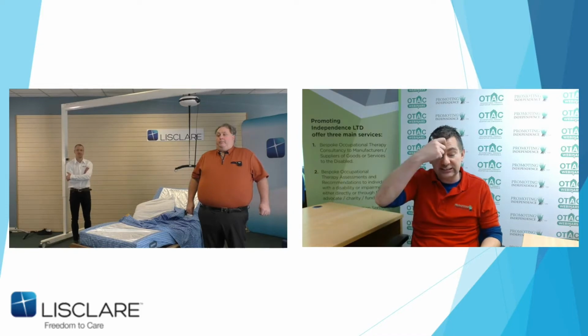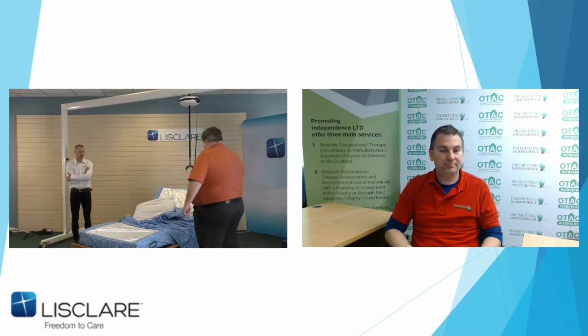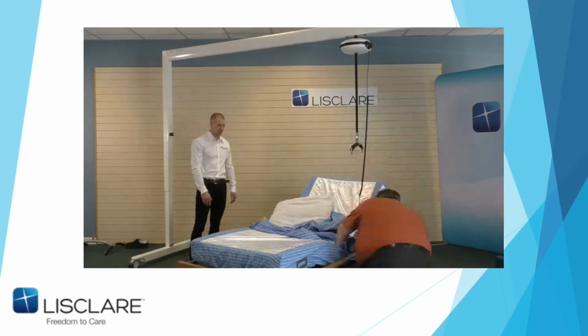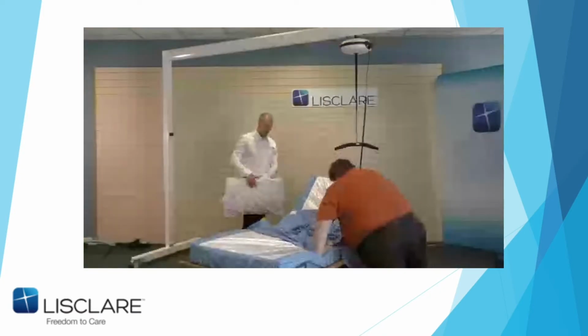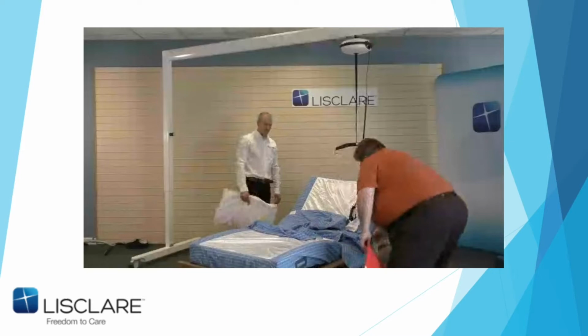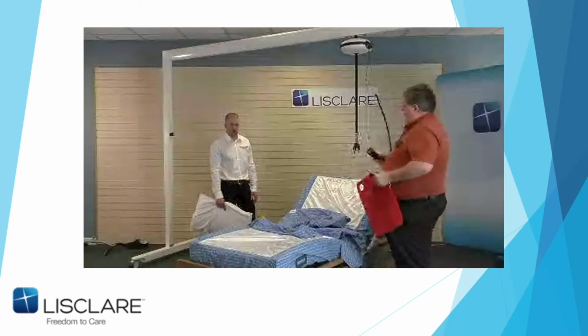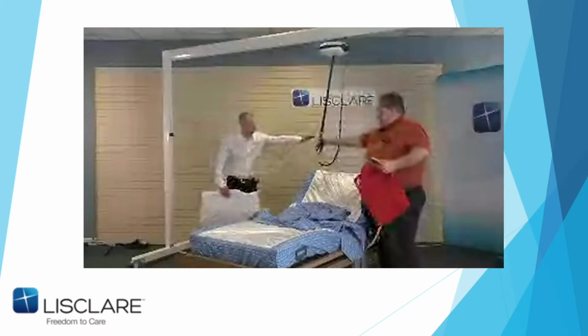Fantastic. Another question is, how do you get the creases out of the sheet when somebody's on the bed? Not a problem. Right, just let me get the side sheet. There we go. Just to show you, it's still pretty fit. Now, when a person gets onto this, they're usually hoisted onto it. I said to Stuart at the start of this meeting, if you take that out of the way, please, John.